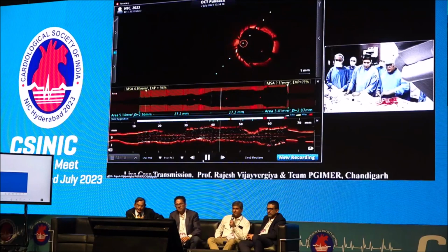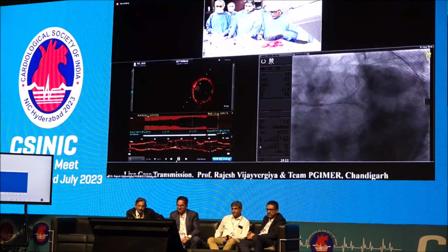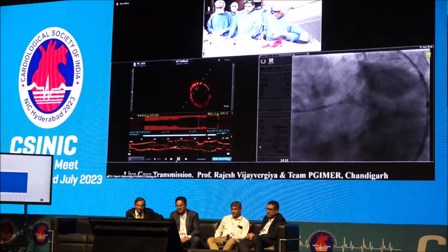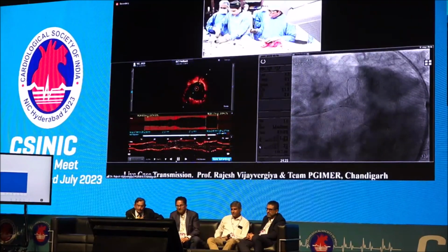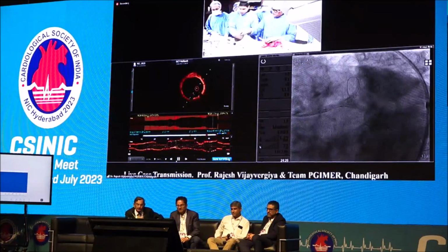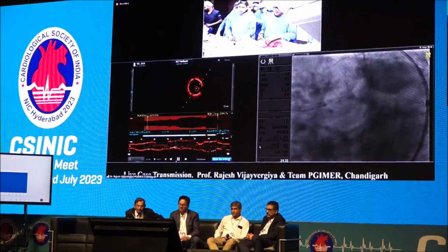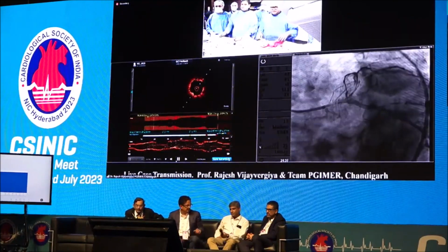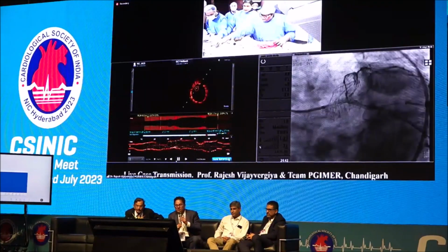Can we have the live pictures now, please? Yes. Very good, we have removed the stent balloon, and a 4 millimeter balloon is there across the left main to LAD. Let me take the 3.5 NC balloon for the final kissing followed by POT. So that's the plan. And this is the angiogram before doing the kissing balloon after putting a stent across the ostial LCX.